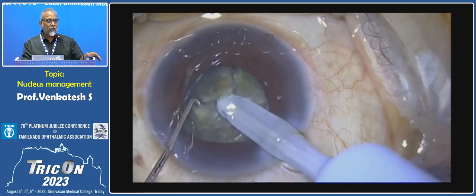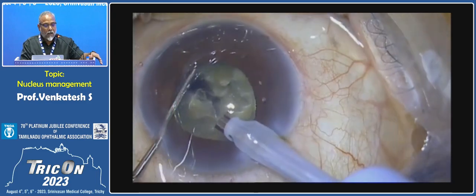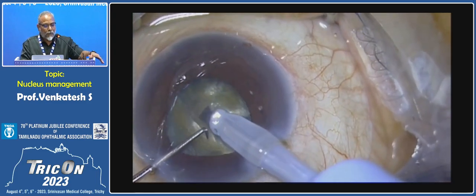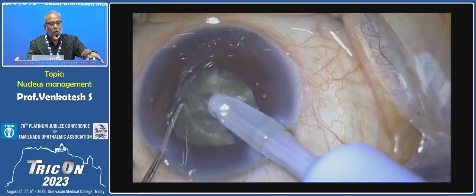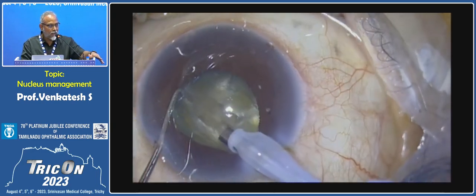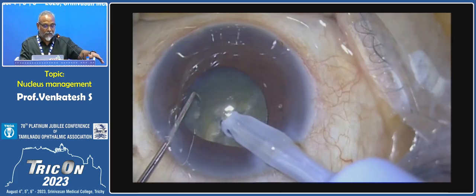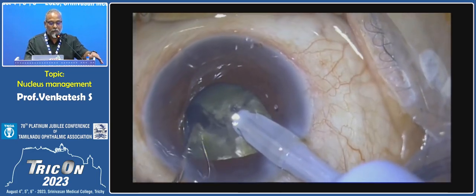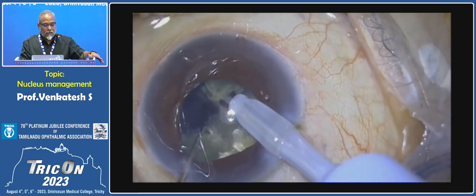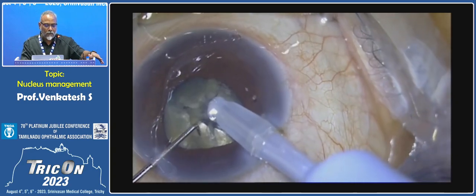So what you notice mostly in this technique, the beauty of direct chop, is that the power utilized is just about 20 to 30% of the procedure. Much of the work is being done by mechanical forces. Mechanical forces will not damage the endothelium, whereas phaco energy, ultrasonic energy delivered in excess, will damage the endothelium. Therefore, the direct phaco chop is a procedure that combines the best of both worlds. It enables you to break down the nucleus.